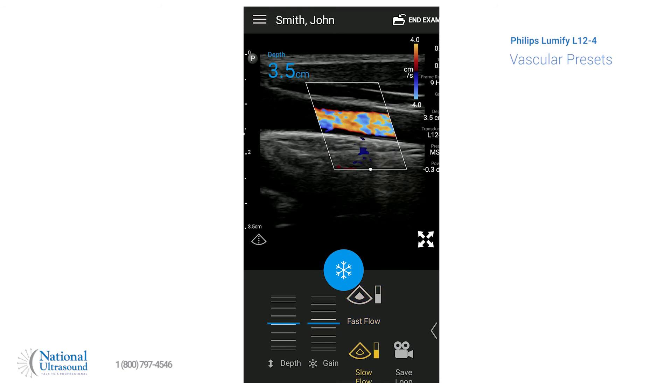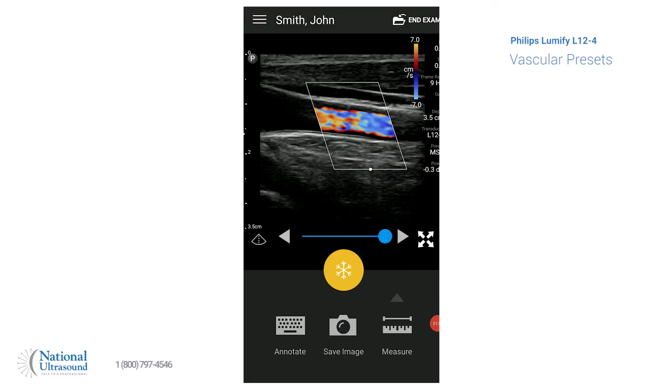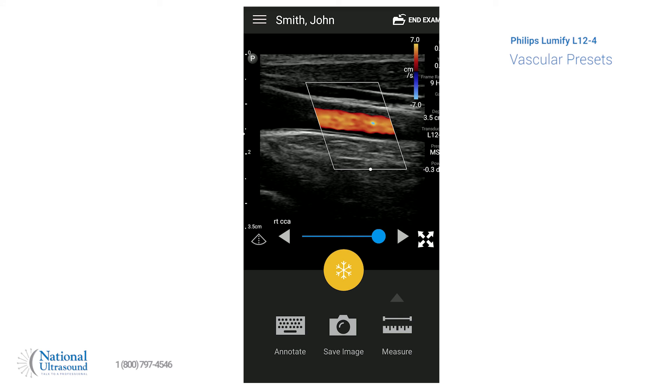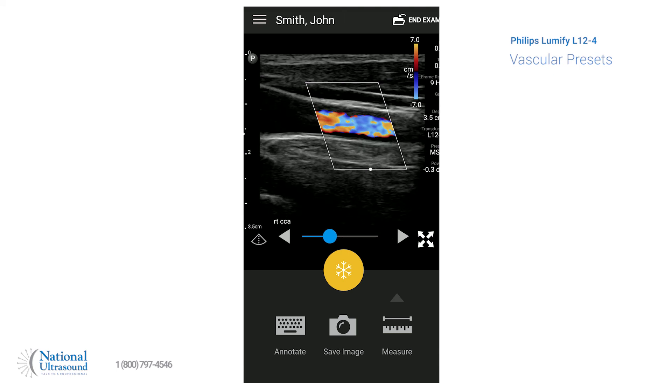You can also have the slow flow option. We'll go back to fast flow, and then when you need to, you can freeze it in the center here. There's also the cine option, so you can cine back. Another feature is the annotation button, so you can add your labeling — it'll show up on the bottom. You can save that in the center of the screen, and then you're free to continue scanning.